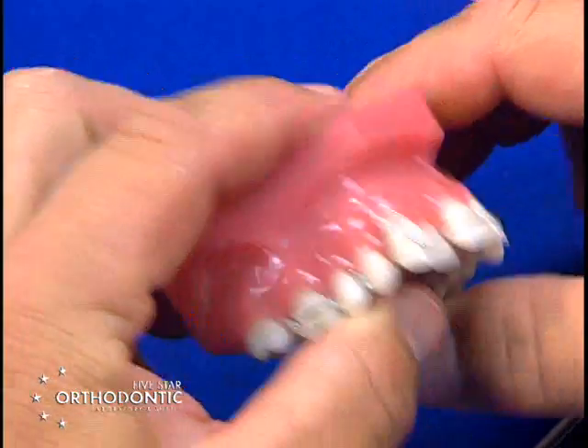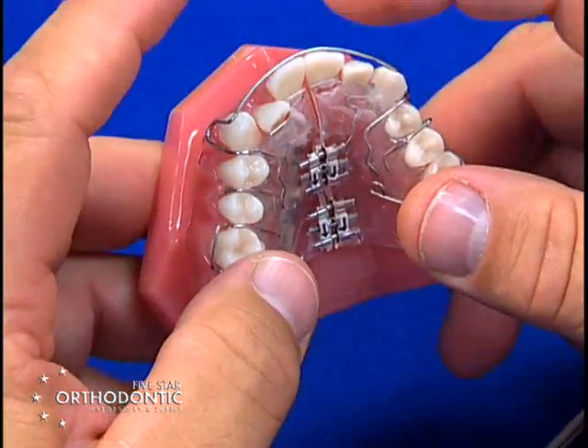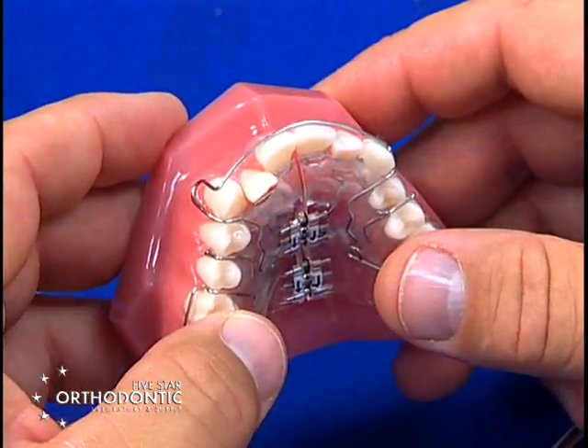Now the bow is centered in the right position. That is activating the labial bow — taking it out of contact and bringing it back into contact.